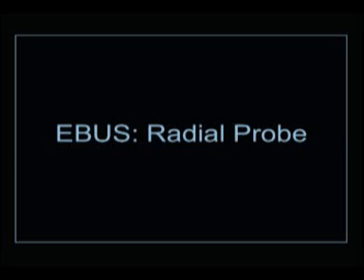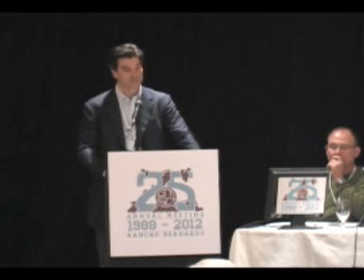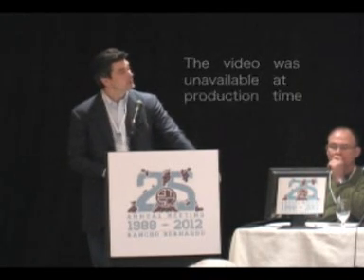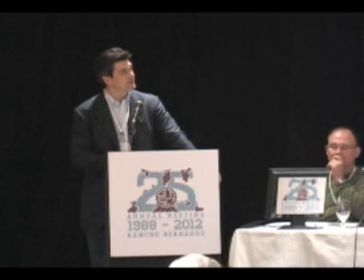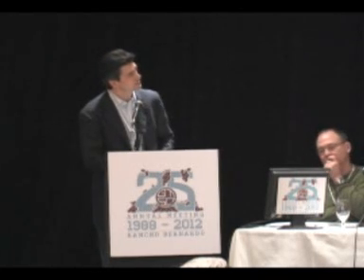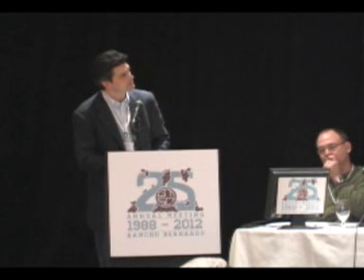Next. This is a brief video here of a patient of mine that we just operated on, actually. He was a 31-year-old kid, treated for 2 years for asthma and was found to have an adenoid cystic carcinoma. By biopsy, it began 2 centimeters distal to the carina. We did a miniature radial EBUS on him. And you can see here the normal rings. And just as you go distally, you're starting to see a little bit of loss of the normal structure. And this represents the tumor.